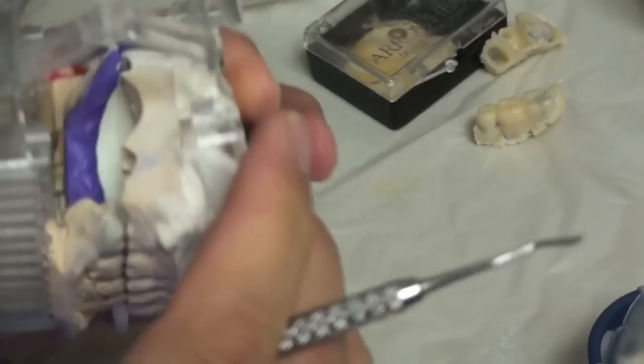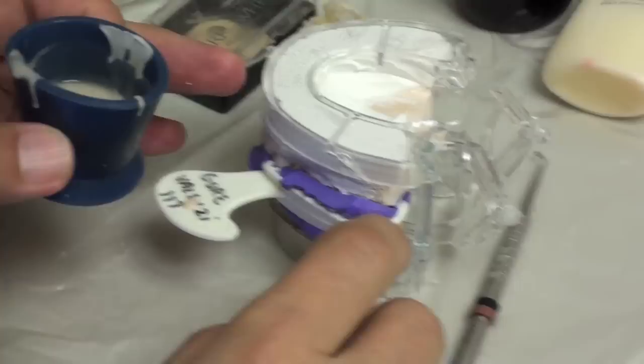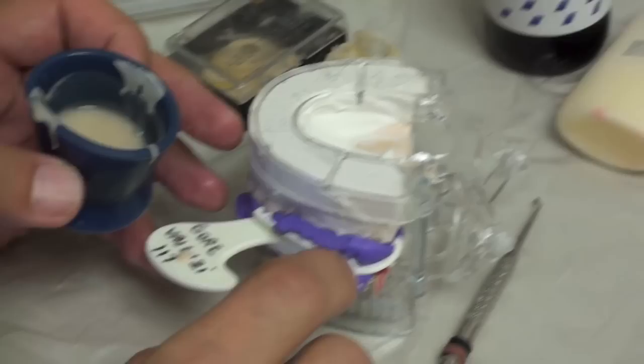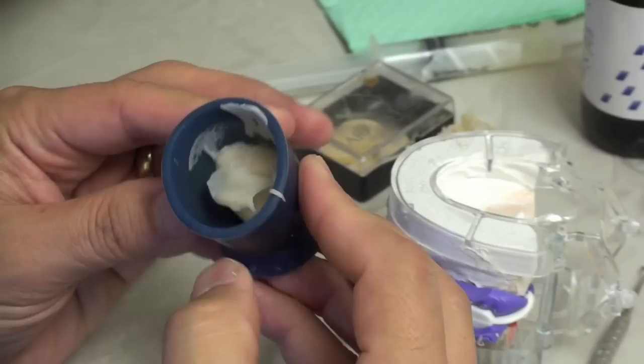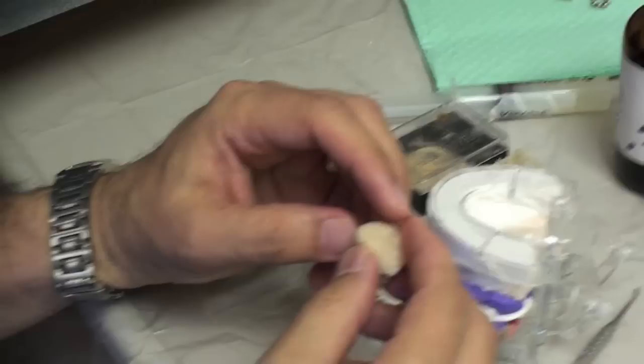Now if that was a live patient, you would be taking a saliva ejector and holding it near their mouth to just get the fumes out. You might be also suctioning up some liquid, but this stuff really stinks. So if you put the saliva ejector just nearby, it just wafts away some of the vapors. Now we're going to monitor this and see how the set is extra-orally — this will give us some idea of how set this is in the patient's mouth. This is really important because this stuff gets really hot, especially in large quantities.